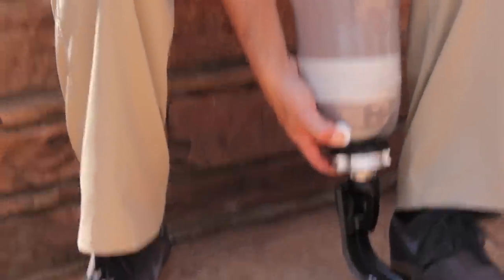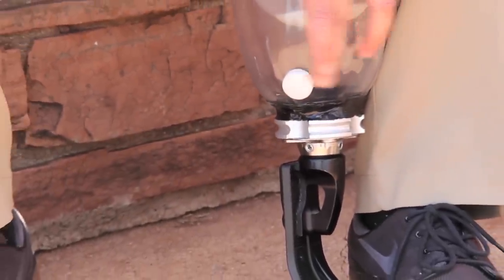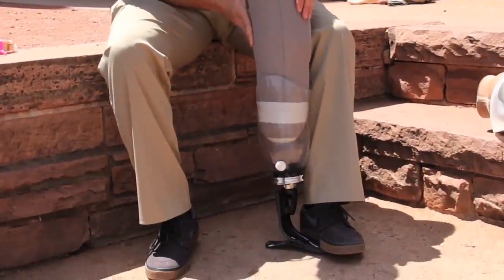To extract your limb from the prosthetic socket, compress the release valve and pull your leg out of the prosthetic socket. At times, you may need to continue to compress or hold in the one-way valve button on the side of the prosthetic socket.